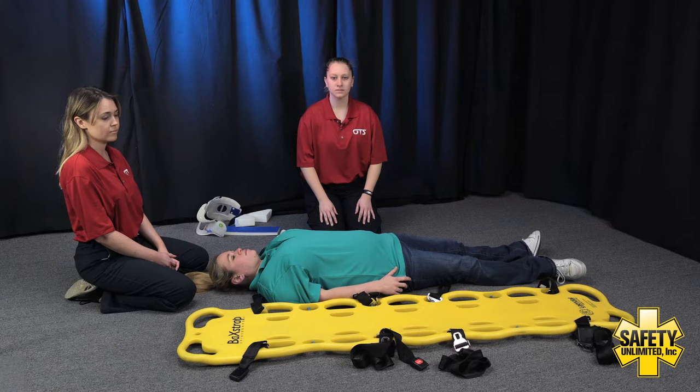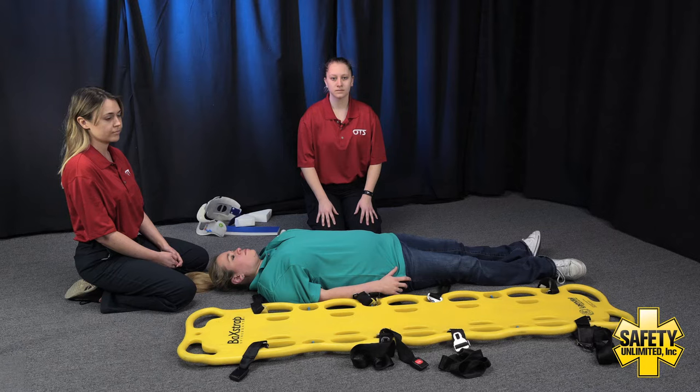When moving the simulated patient to the device, you should use the help of the assistant EMT and myself. The assistant EMT should control the head and cervical spine of the simulated patient while you and I move the simulated patient to the immobilization device. You are responsible for the directions and subsequent actions of the EMT assistant and myself. You may use any equipment available in this room. You have 10 minutes to complete the skill station.